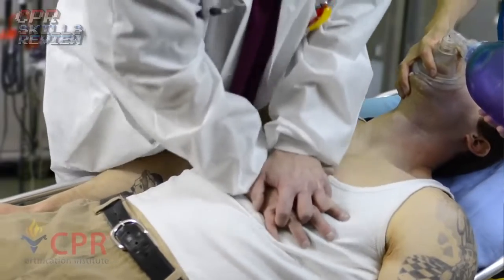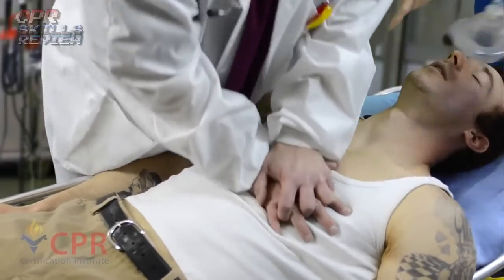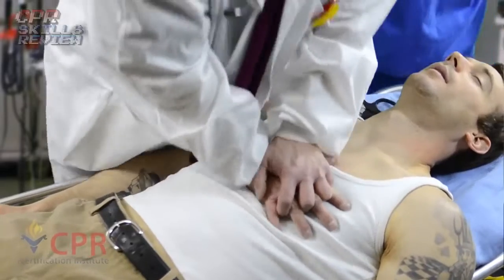Nurse, where the hell is that AED? The AED is here now. Hand me those shears — let me get this guy's shirt off.